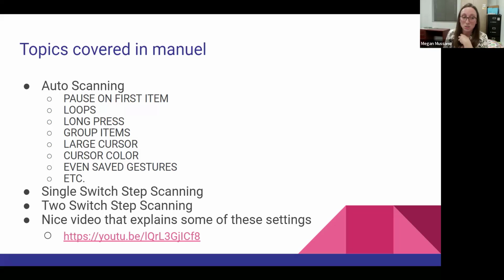Again, though, my students weren't able to differentiate between the long pause, or physically they couldn't do a tap and a long pause. So I had to search for other options. And I think some of you probably have had to search for other options for accessibility too.